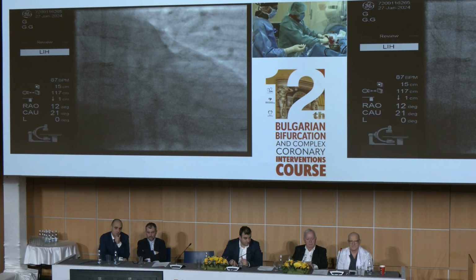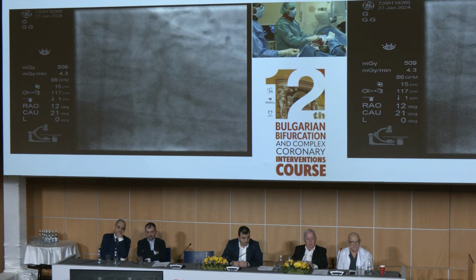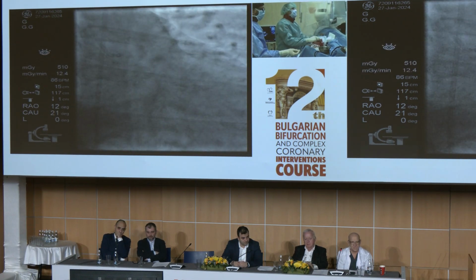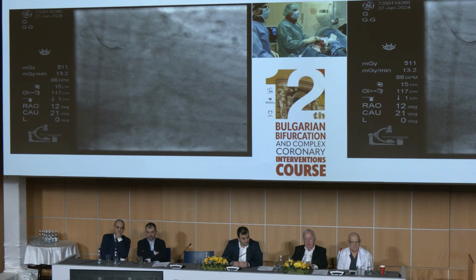We have a new one. Okay, so we will do the vessels sequentially, circumflex, and then LAD.